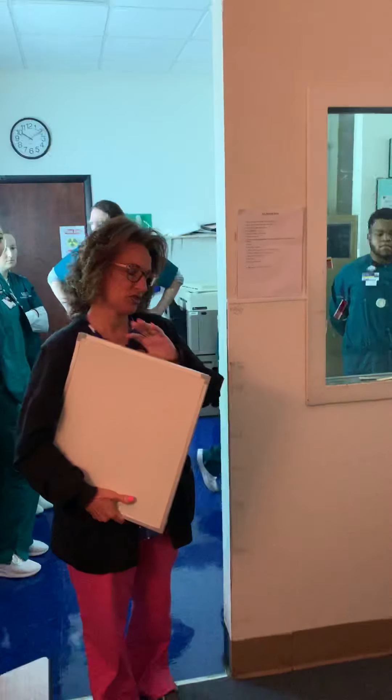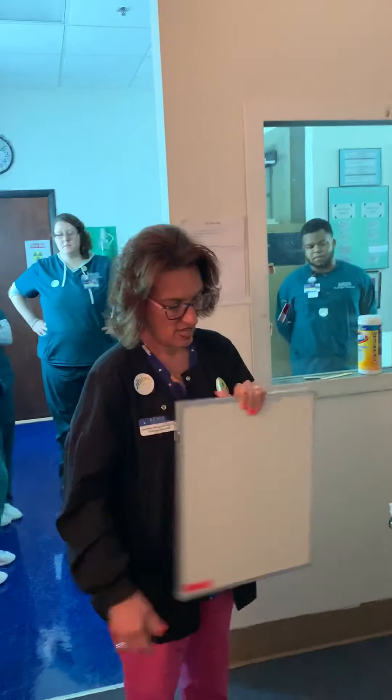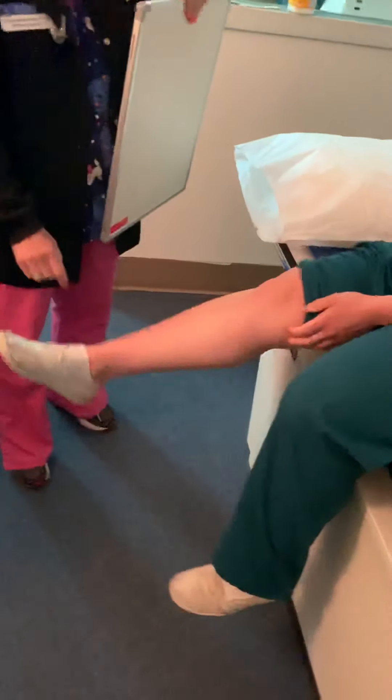My patient's already been confirmed. She's not pregnant. We got history. She's who she says she is. She's already rolled up her pant leg. The only thing we'll need is shoe and sock off.